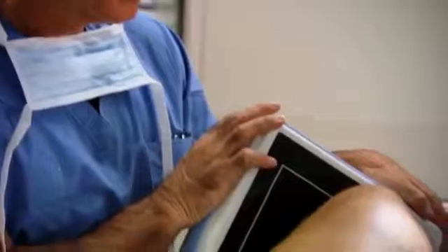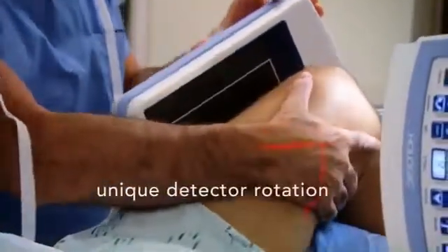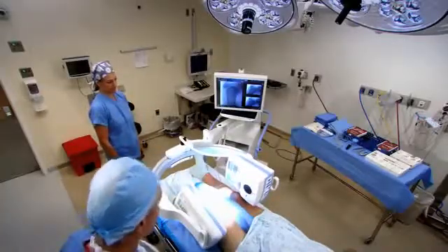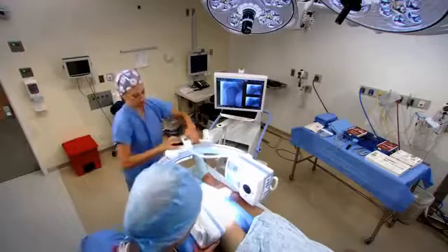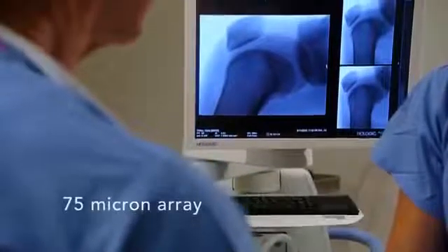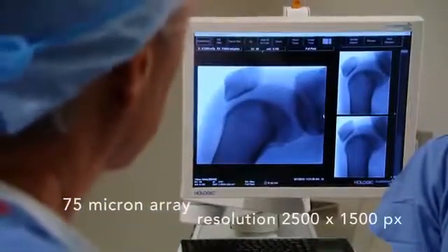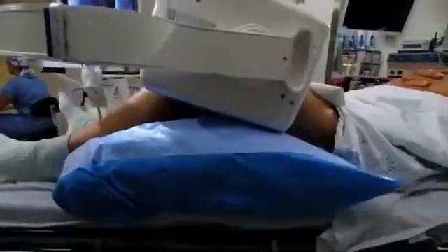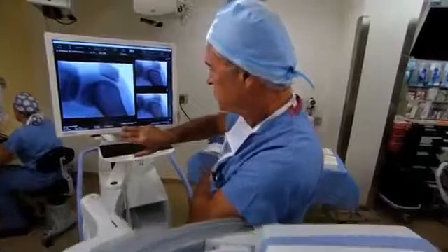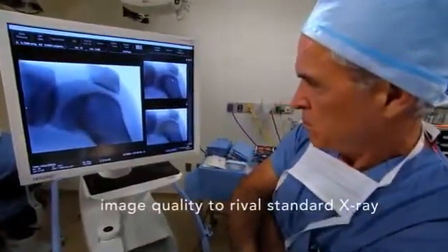Only the Fluoroscan Insight FD offers the unique capability to rotate both the detector and collimator, making it even easier to obtain the desired view. The detector image array has a density of 75 microns and yields a resolution of 2500 by 1500 pixels. Our advanced image processing algorithms offer distortion-free images, which deliver exceptional quality and impressive fine detail.